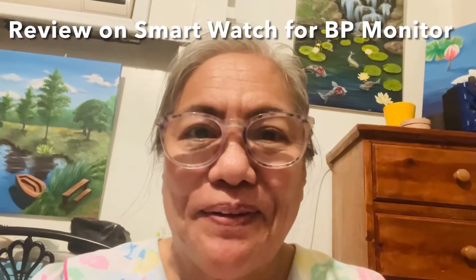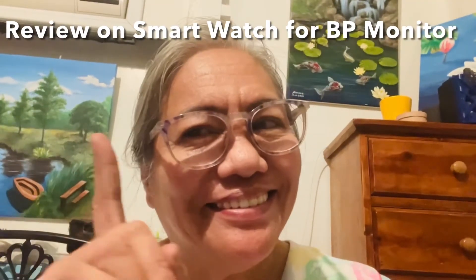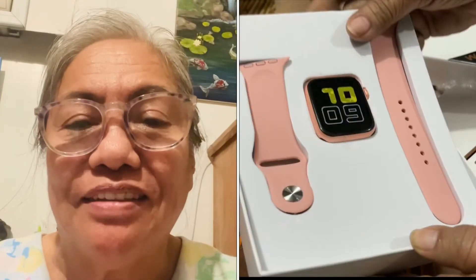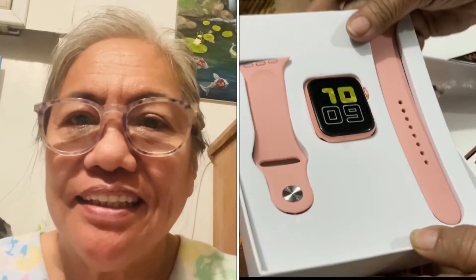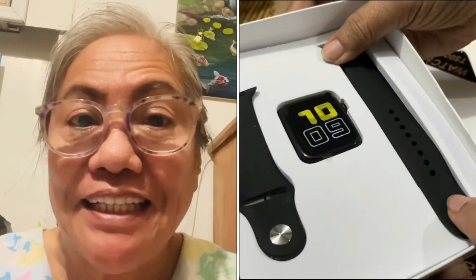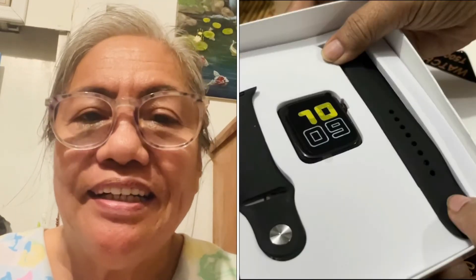Hi, this is Happy Rich Mama. Today I'm going to talk to you about the watches I bought for me and my husband. Alam mo naman tayong mga lola, kailangan palagi nagkotake ng blood pressure. So we bought these two watches primarily for the purpose of taking our blood pressure, kasi nasira na yung aming pang-take ng blood pressure.